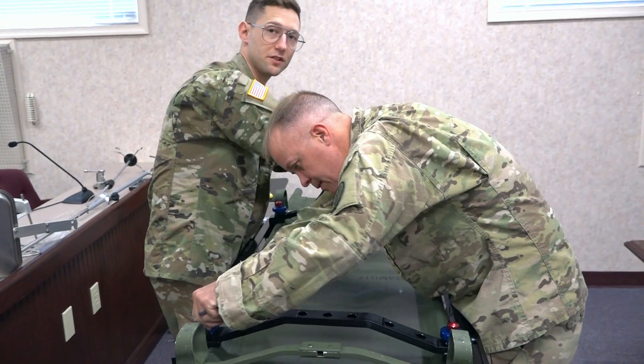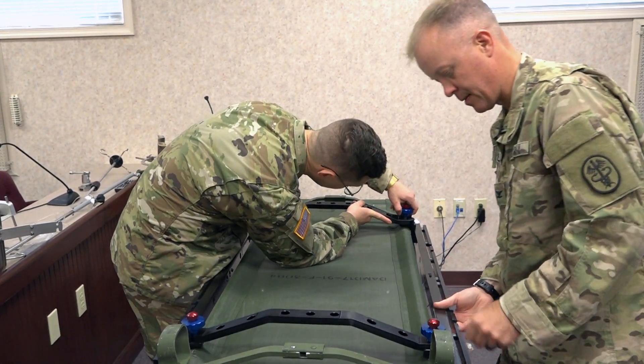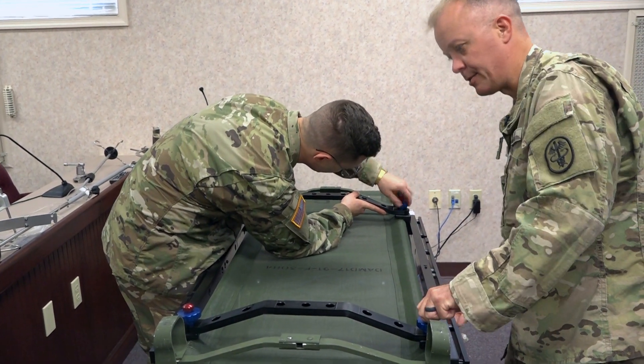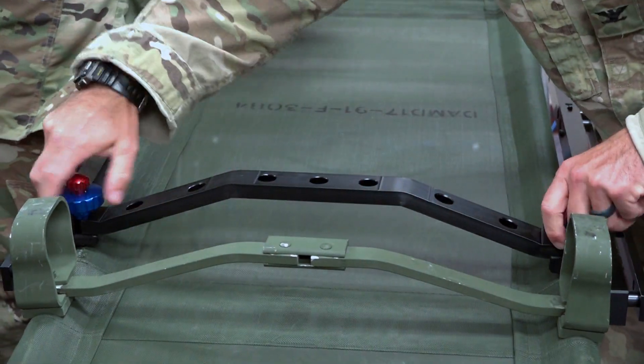Then you work across the table to hook in the crossbars to the other end. I'm working on his end and he's working on my end to secure the crossbar portion in place. Then you screw the red screws down first, followed by the blue ones.